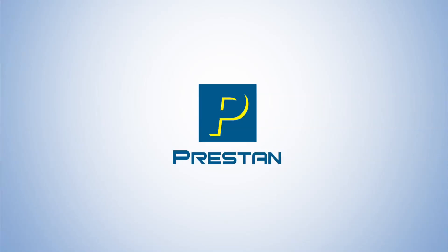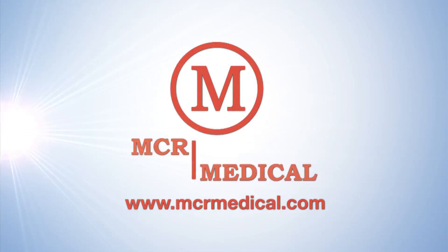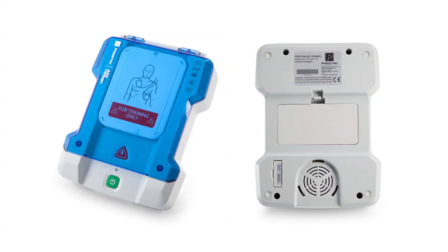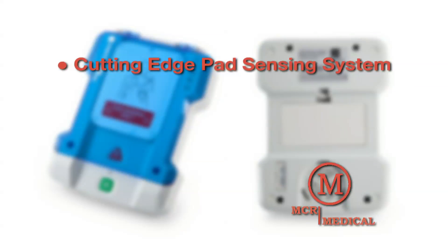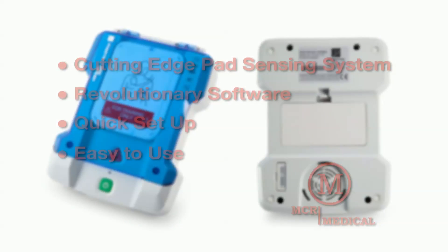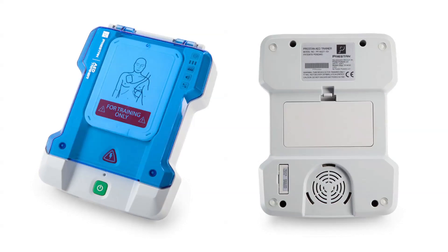The Prestan Professional AED Trainer, available from MCR Medical Supply. Bringing you all the quality, durability, and affordability you've come to expect from Prestan products. Combined with a cutting-edge pad sensing system, revolutionary software, quick setup, and it's so easy to use, this trainer gives instructors the most reliable AED training tool available on the market today.